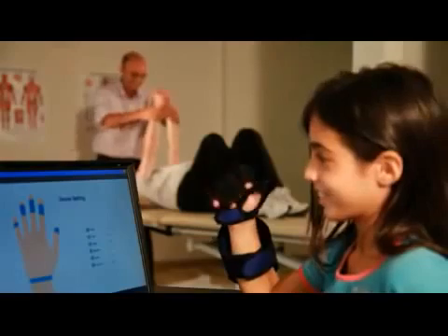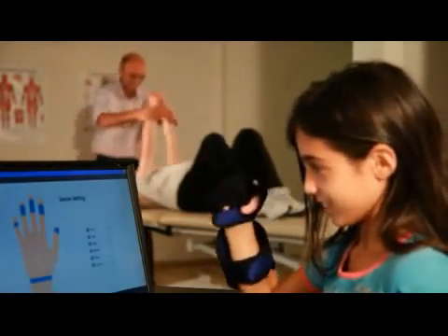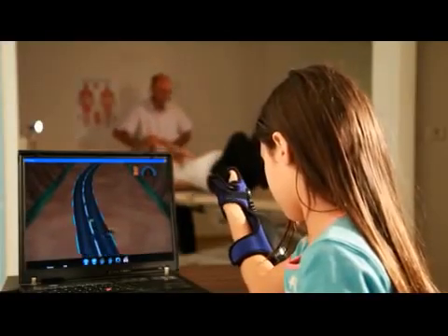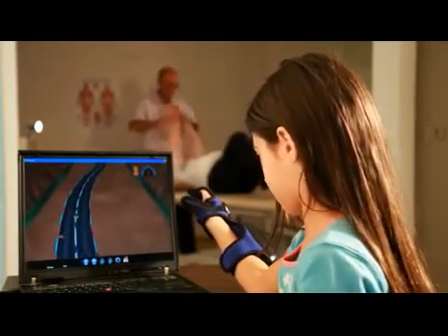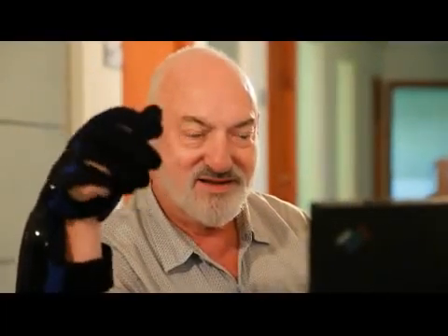The HandTutor system uses dedicated rehabilitation games in the form of challenging and motivating virtual functional tasks. The system provides quantitative documentation on the patient's rehabilitation program. The HandTutor is affordable and reliable, being used worldwide by occupational and physical therapists. It is suitable for acute and chronic treatment of children and adults.